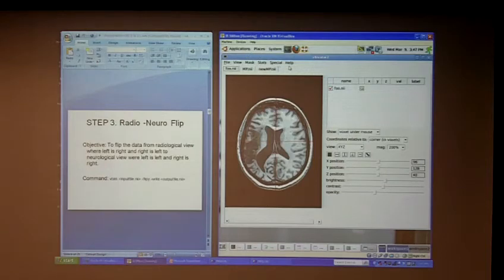That's for that particular DICOM format, right? Because last week I mentioned that whatever, right-handed, left-handed, it can be flexible. Sometimes you can show on the right side the neurologic convention. Yes. It's worse than that. You basically have to know what comes out of wherever you're getting the images. I was going to say, yeah. So my question was, what in the DICOM format do you actually read out and then use to determine the convention?